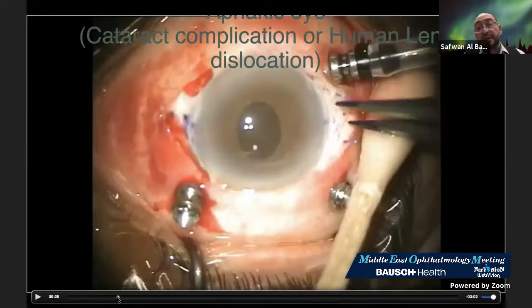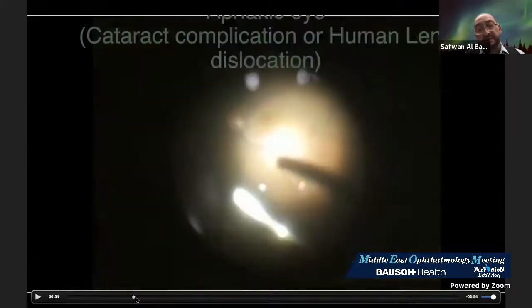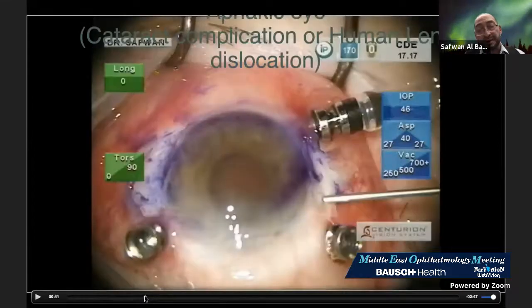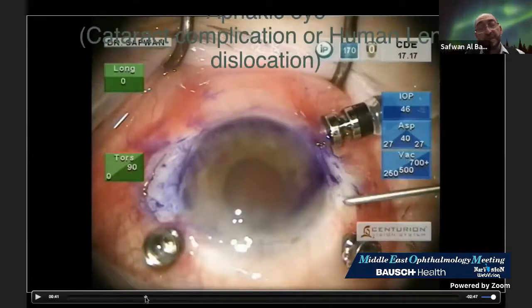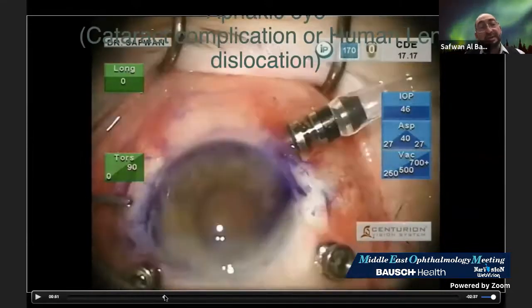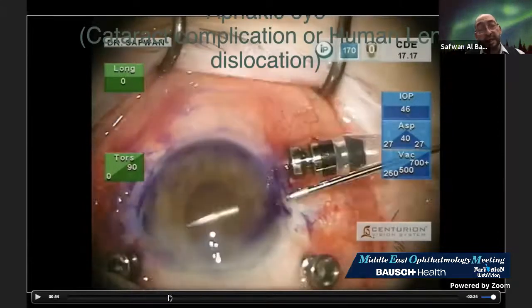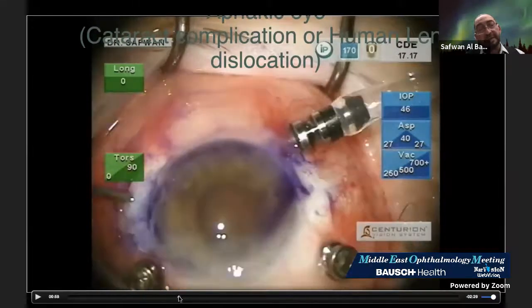So here, when I prepared everything, I went to finish my duty inside the eye, where I removed all the lens material and returned back. Now, in this step, I will go to the MVR and open the sclerotomy site here. Each one, making sure that I'm in, tip in, and then I will test my gauge 23 forceps. See, this is the gauge 23, either serrated or tying forceps, and then implant the lens.